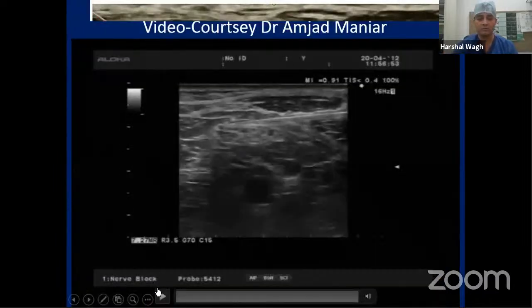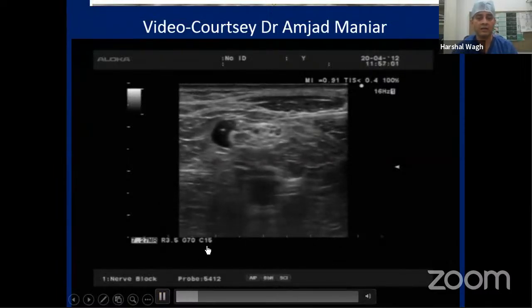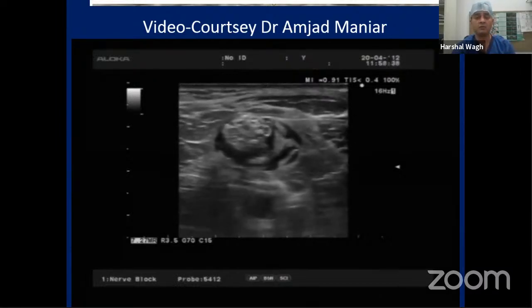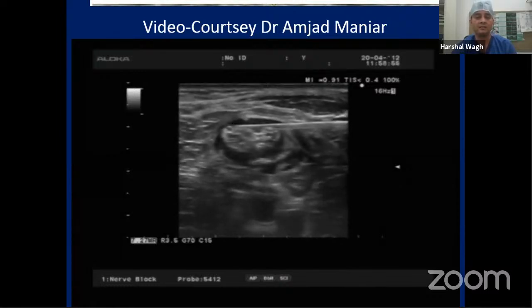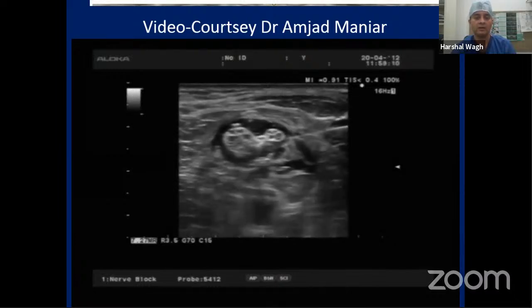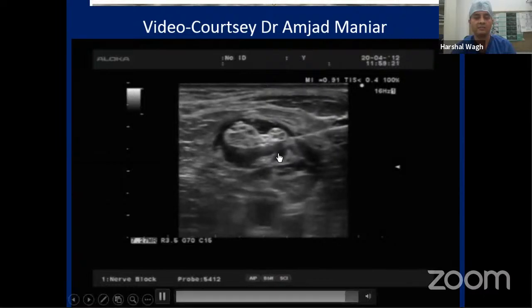Again, special thanks to Dr. Amjad for this video, because I think the video is brilliant and it shows how in-plane needling is done for a popliteal nerve block, where once the injection is done, you can actually make out the common peroneal nerve and the tibial nerve in its separate entirety, and the local anesthetic is nicely surrounding the nerve. So Dr. Amjad, thank you again for that. That's a brilliant demonstration of that local anesthetic around the popliteal nerve, just as it bifurcates into these two entities.